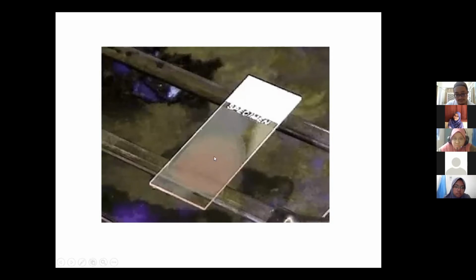So we want to view under the microscope in this area here. When you smear this slide, it should go from here to here, about 60 to 70%. Nice. We don't want the aeroplane to take off too fast. Here, it has not done anything and it has already taken off. No. We want the aeroplane to go a bit further before it takes off. Okay, it runs here, then it takes off, nicely. You imagine that. When you do the smear, you imagine an aeroplane taking off.